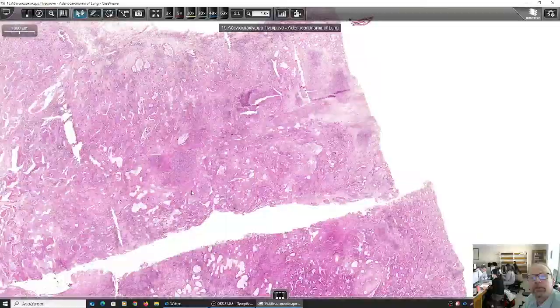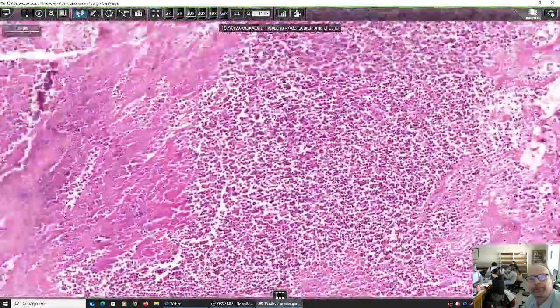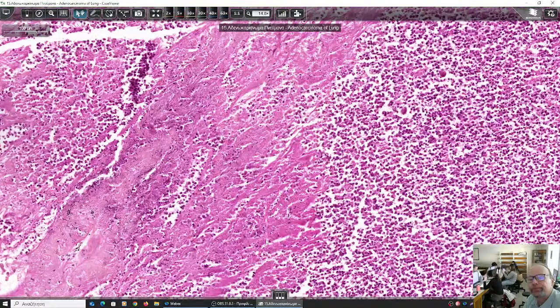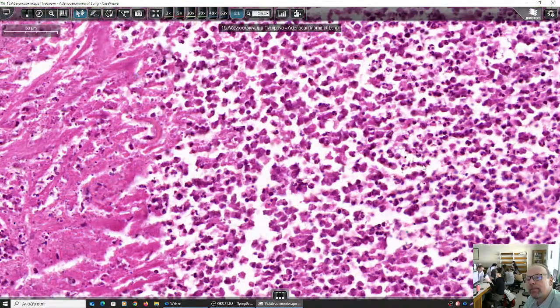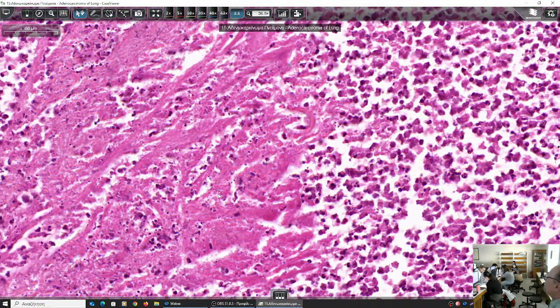And what else can we say? What has happened here in the cancer? What area is this? It's inflammation, acute inflammation with neutrophils, and this tissue. What happened to the cancerous tissue in this area? It died. Necrotic. Because this is a sign of increased biological aggressiveness.